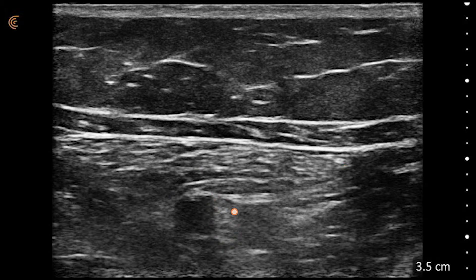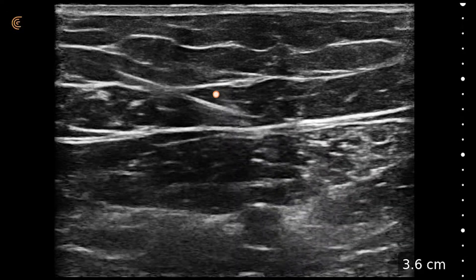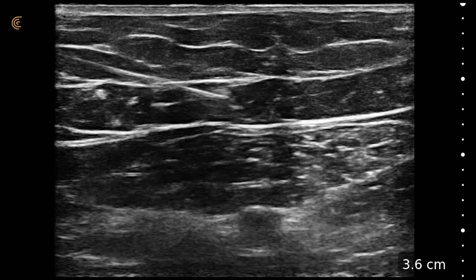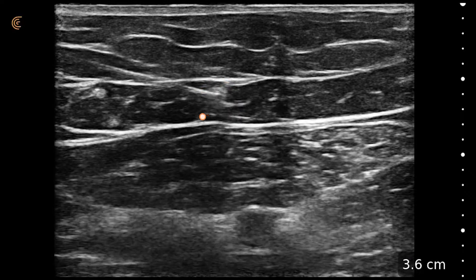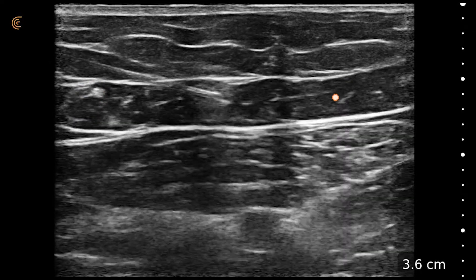Now let's take a look at something we've never paid attention to before. Let's go up a little bit more proximally and look right here. That looks kind of like a nerve, that looks kind of like a nerve, and that looks kind of like a nerve. We'll show you how easy it is. I'm just going to come right in here around one of these nerves and inject in this area, then come back and inject in this area, and then inject in this area.